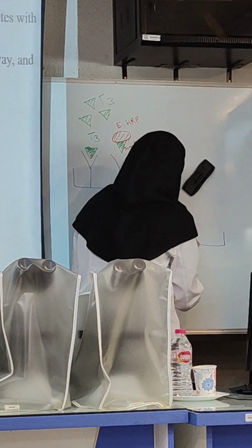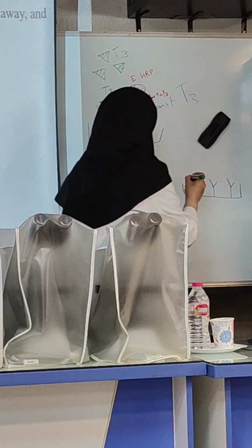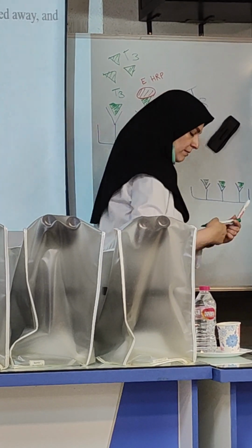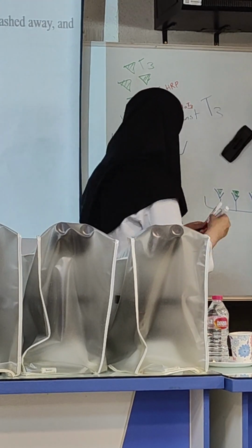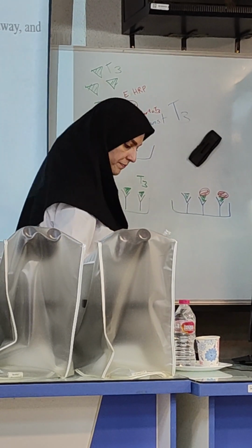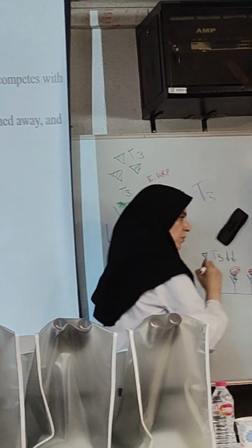Hypo means that there is a low concentration, because T3 is very low.